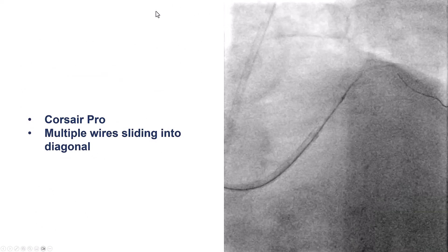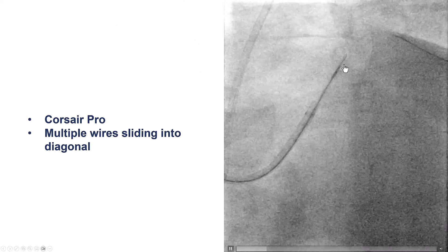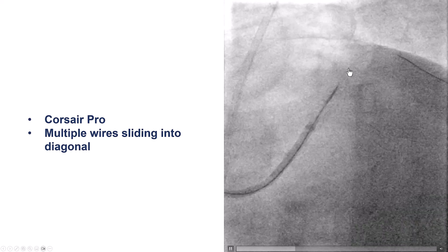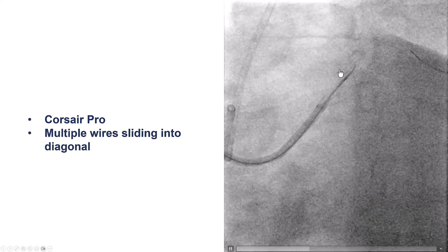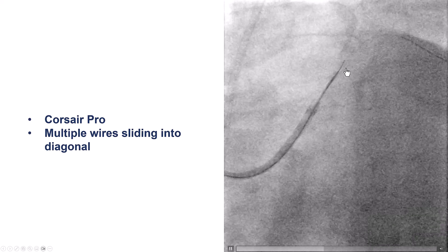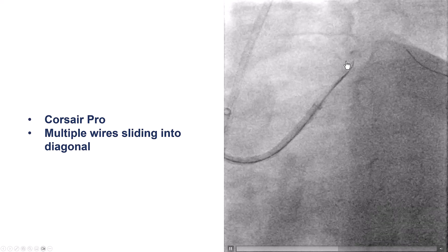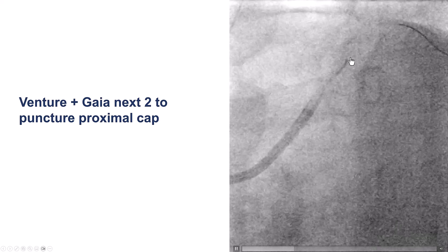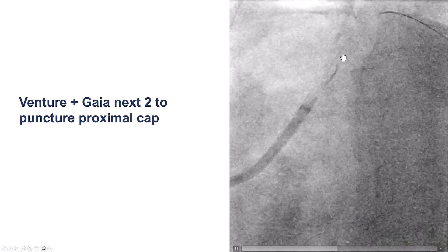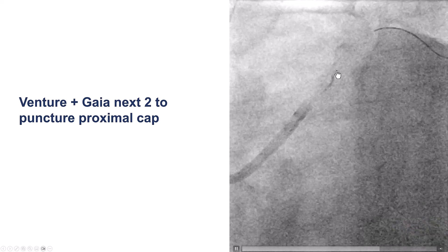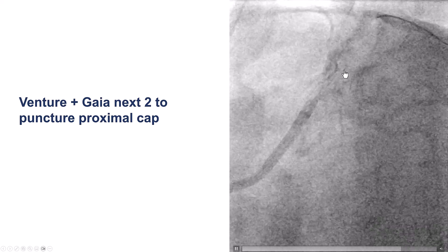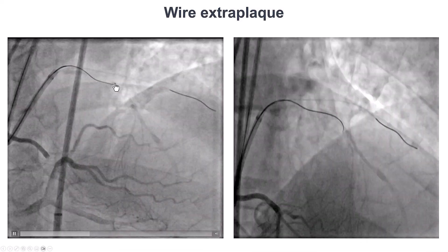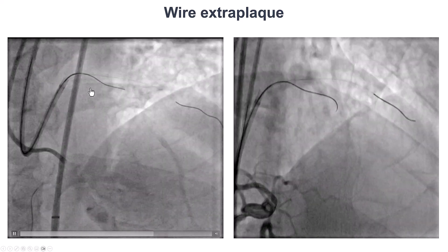We tried antegrade wiring using a standard Corsair microcatheter. The issue was that all the wires wanted to slide into the diagonal branch. To achieve more angulation directing the guidewire into the proximal cap, we used the Venture microcatheter, which is angulated and provides very strong support, along with the Gaia Next guidewire. After doing that, we were able to advance the wire along the course of the LAD.